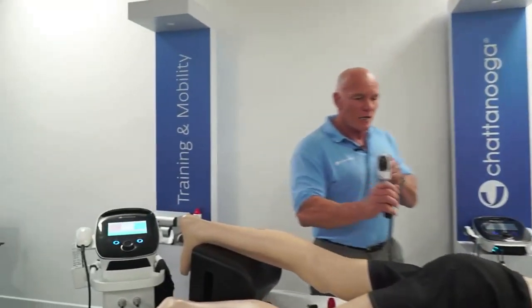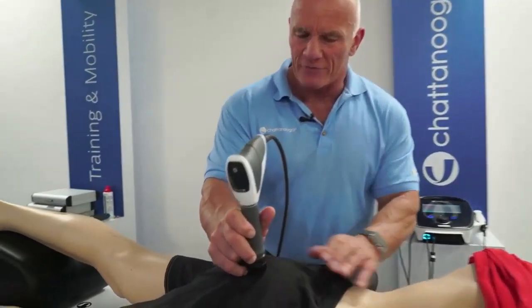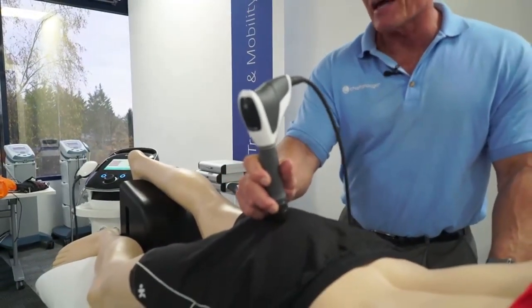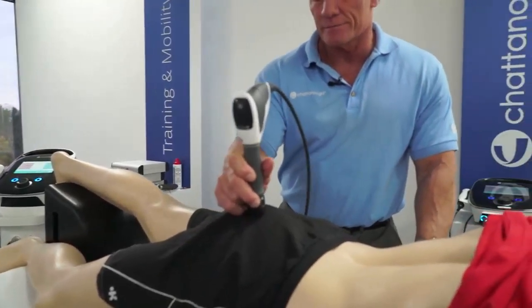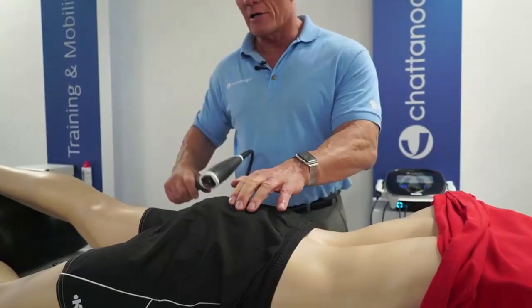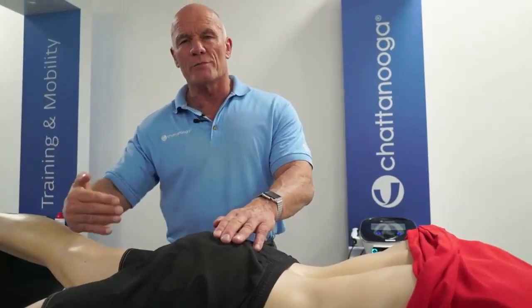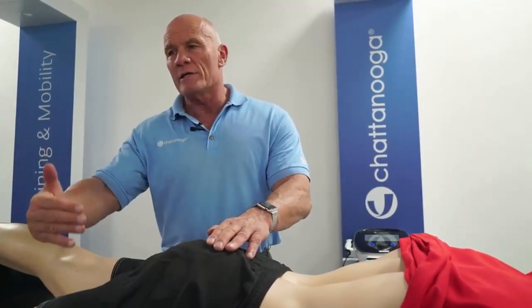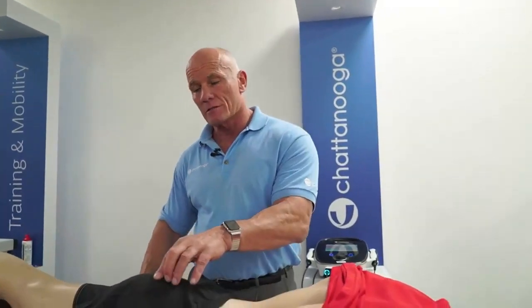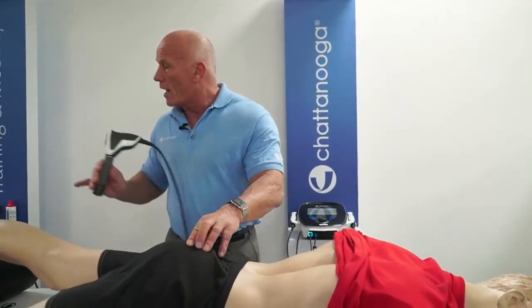So, now I'm going to work in small little circles over that area using that 15 hertz. I'm going to apply around 2,000 shocks to that area. After I've done that, I'm going to retest. So if I had reduced range of movement, I can recheck to see now whether I've got full range of movement. If I haven't, I may choose to administer some more. So I may repeat the treatment.